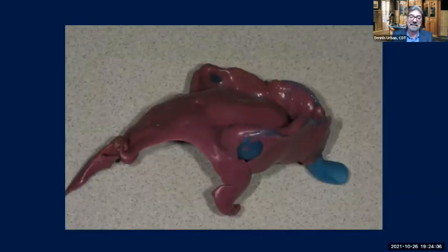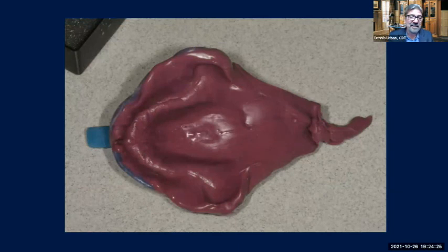This is an actual case I got in the laboratory. I feel so bad for this patient. This patient must have swallowed this impression material halfway down to his stomach. The patient was probably laying back in the chair and it just went down his throat. We sent this back to the doctor. Actually, we made a new custom tray. But you can see in the second picture here, on the anterior section at the periphery, nothing was border molded. You have this tray showing through. We have all that excess material that went all the way to the posterior part of the patient's mouth. And something like this is really going to be a problem.